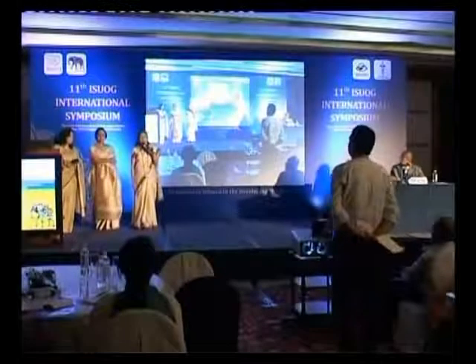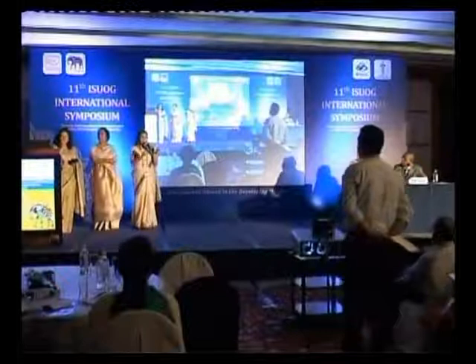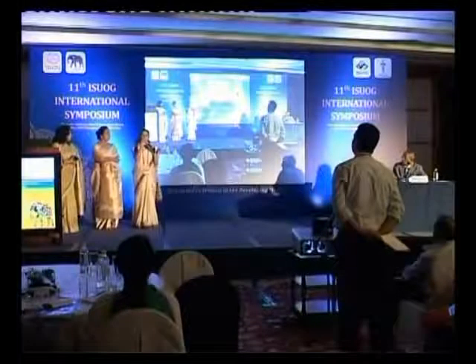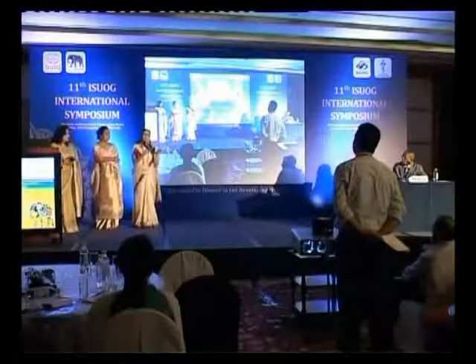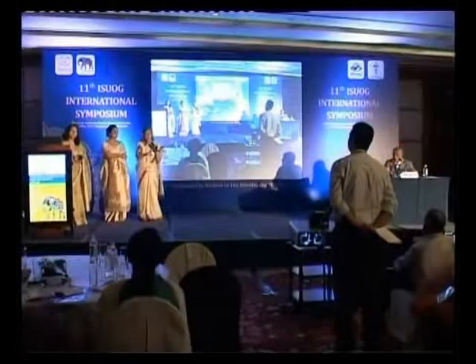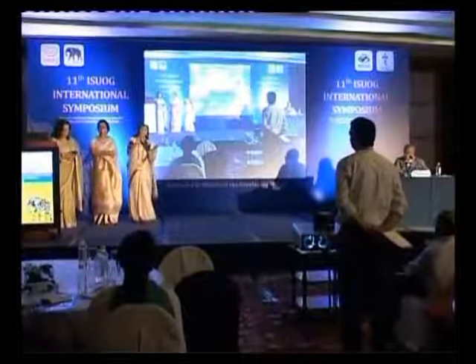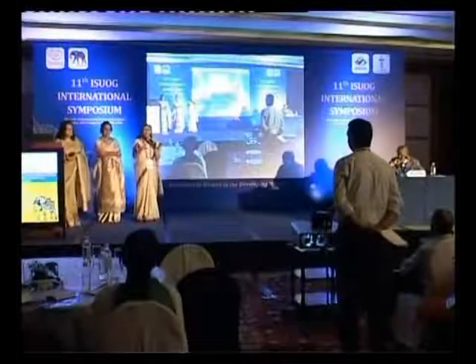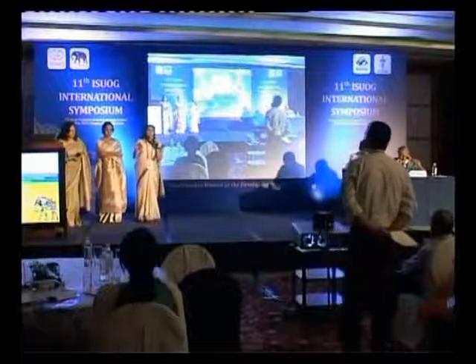You are absolutely right, and I take this point positively. Yes, that is very true, and it has been shown in several studies. We have also observed that whenever there is a fibroid or adenomyosis, or for that matter any large lesion in the uterus, the uterine artery resistance is going to be lower, and you may sometimes falsely think that the uterine artery resistance is normal.